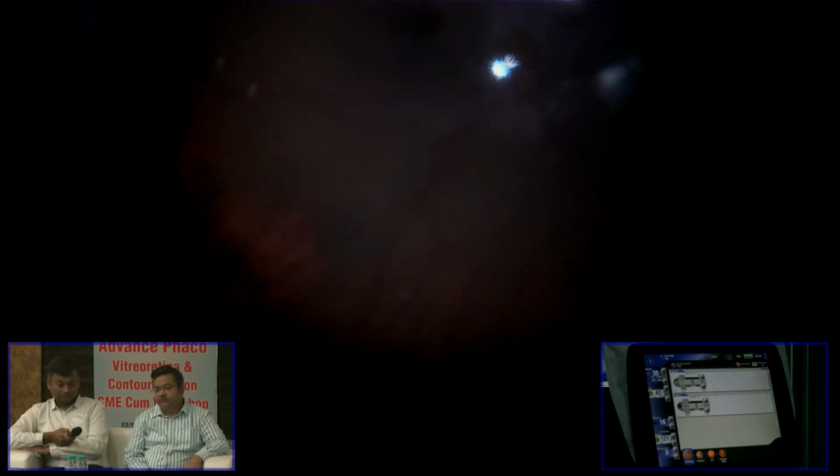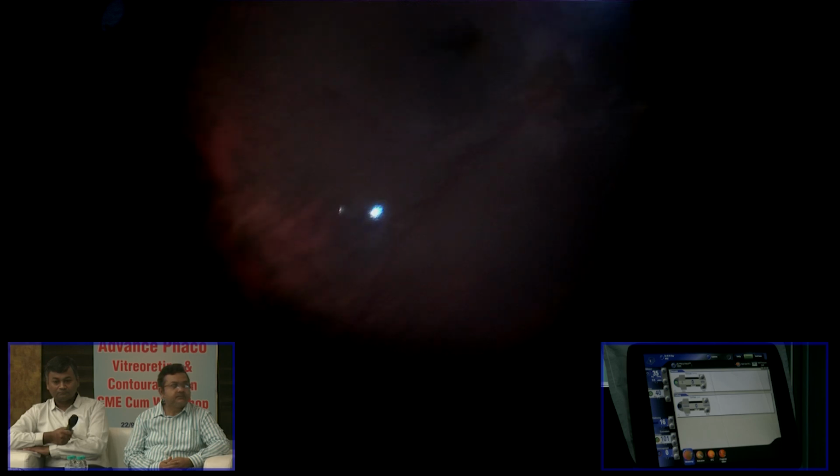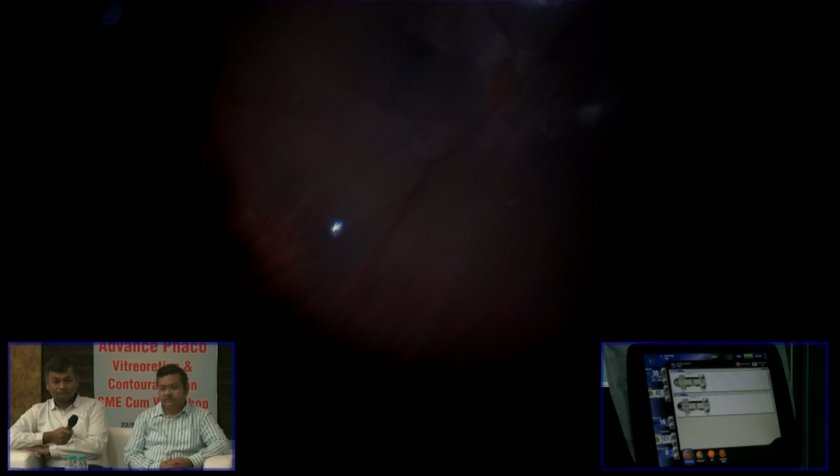Sometimes, when we operate on CRAO patients, when we need to tug disc vessels very vigorously, in those cases I have faced that sometimes I had to use cautery. But in CRAO, since it is already a very poor prognosis case, we need to do that sometimes. Otherwise, in normal cases where we know the prognosis, we should avoid cautery over the disc or any major vessel.